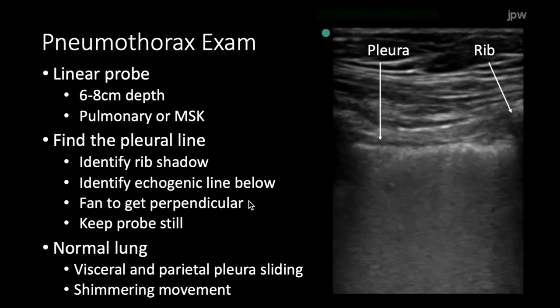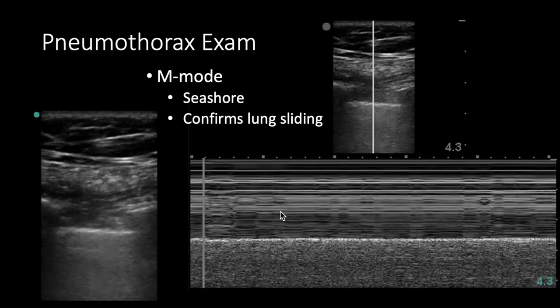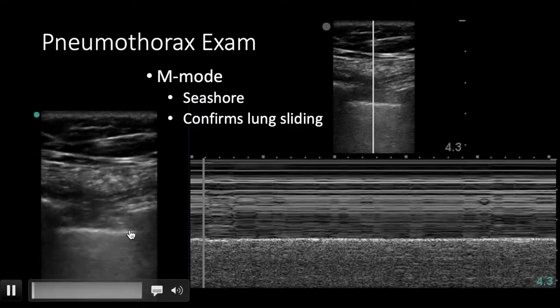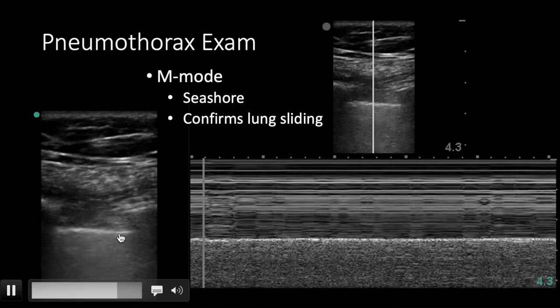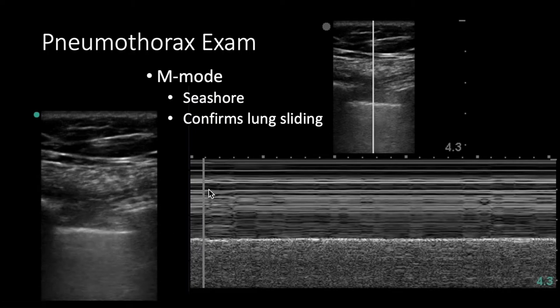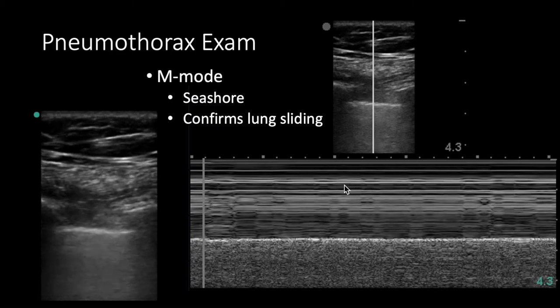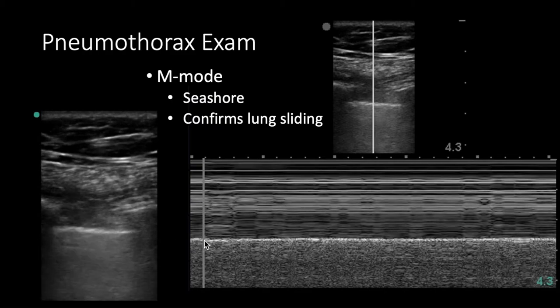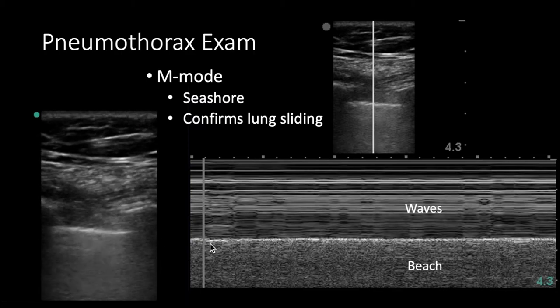Here's another example — rib shadow, so this must be the pleural line. It can sometimes be harder to tell if there's shimmering, so I'll often encourage you to use M-mode: drop a single line through and measure the movement over time. What you see is subcutaneous tissue, a bright white pleural line, and because there's movement, it creates a granular pattern. Some people call this the seashore sign — waves approaching the beach. This granular beach pattern means there is pleural sliding, the visceral and parietal pleura are sliding, and that rules out pneumothorax.